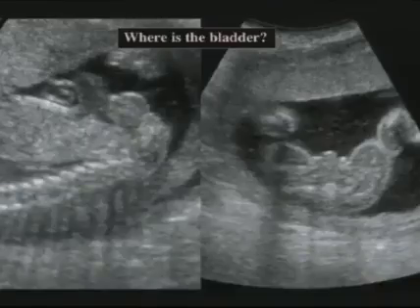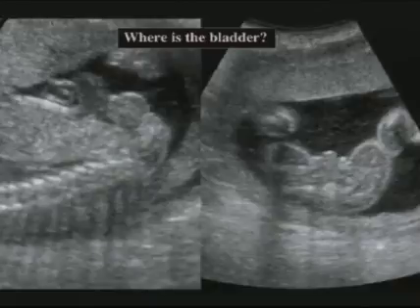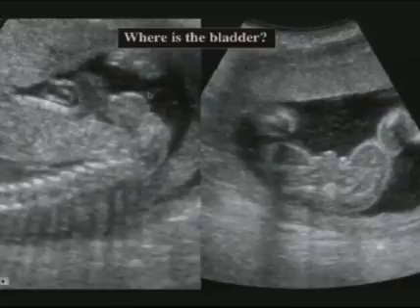Now here's another case in the late second trimester where we're doing a standard survey and we're looking for the bladder. And where is the bladder? Well, sometimes it empties out, as it does on a regular basis, but then it starts to fill very quickly. And if you wait for a little bit, you will see the bladder fill.